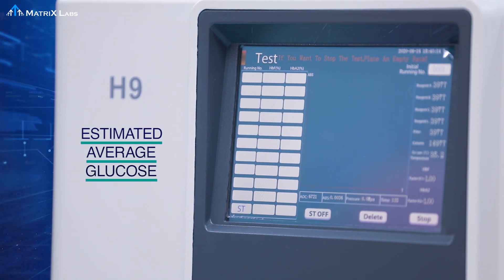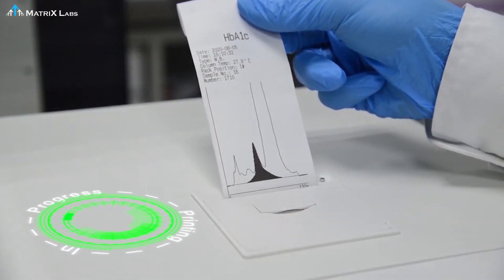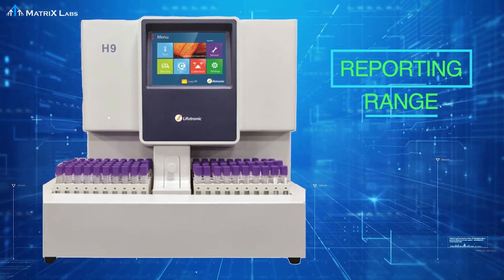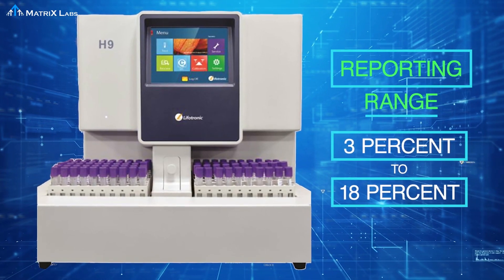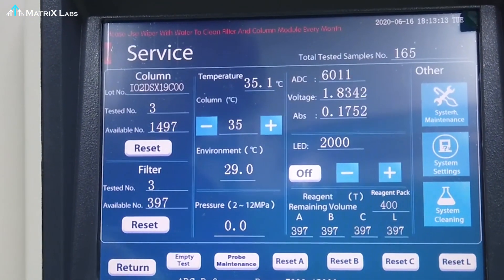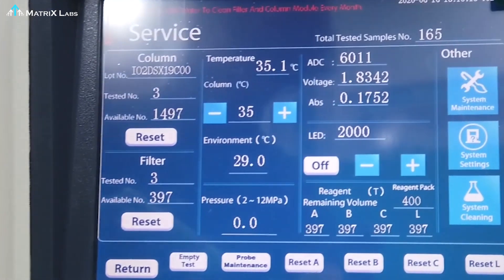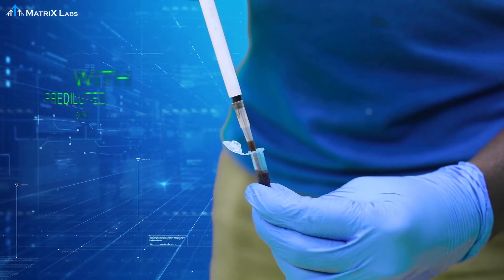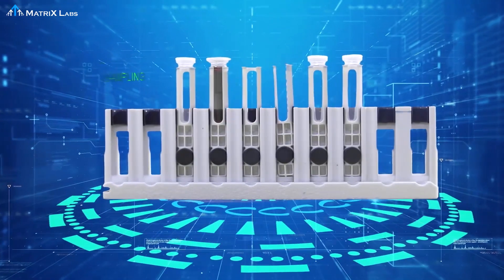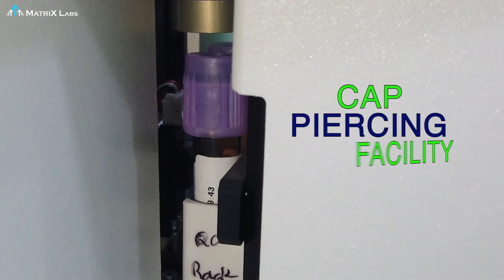H9 comes with a pre-diluted sampling facility and also has primary tube sampling with cap piercing facility.